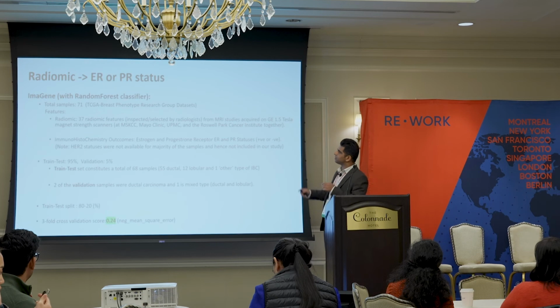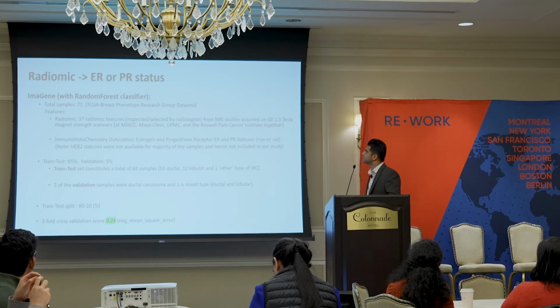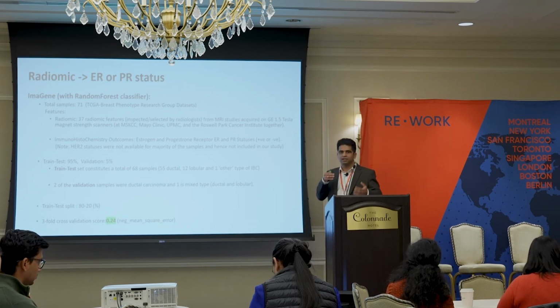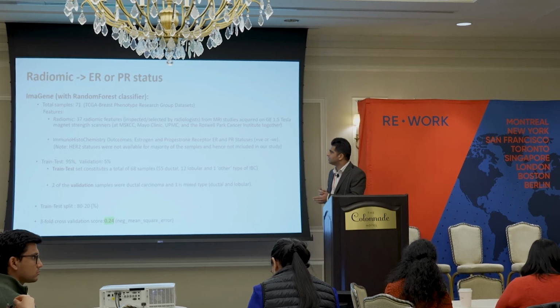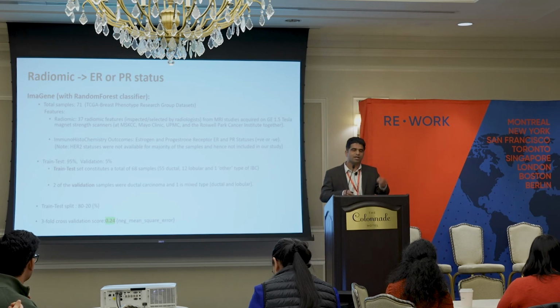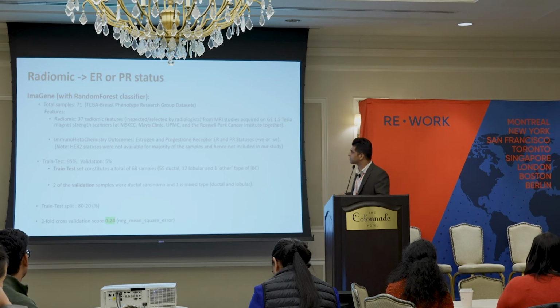The data set used here was from well-renowned hospitals in the United States, such as MSKCC, Mayo, UPMC, and Roswell Park Cancer Institute. It's available freely on the Cancer Imaging Archive, TCIA, and the TCGA portals. The data set was more focused because it was very well curated by radiologists. We only used the curated radiology features as opposed to using all the features, and it was split 95 to 5% between train-test and validation.